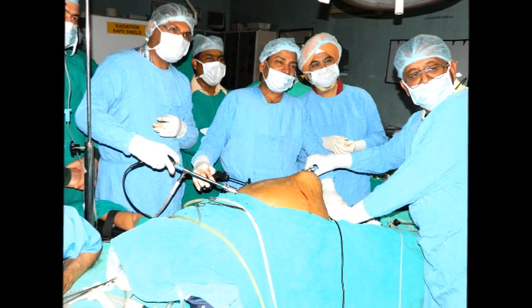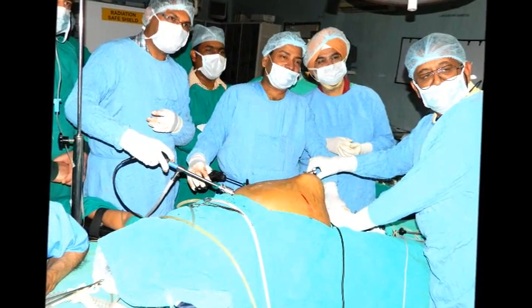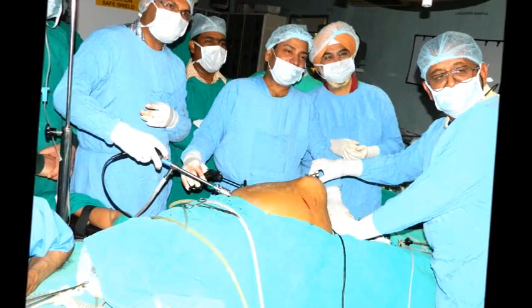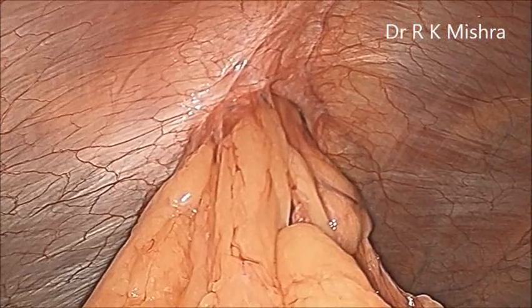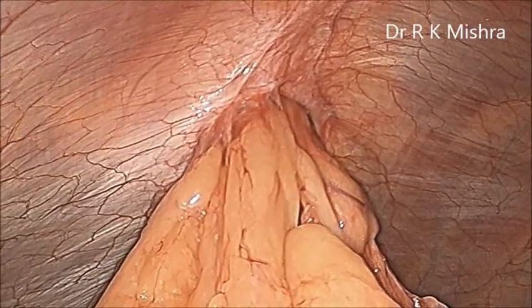This is a case of ventral hernia. This patient has a large 6 cm para-umbilical hernia. She is an old lady, and we have performed the ventral hernia surgery with a good quality mesh.